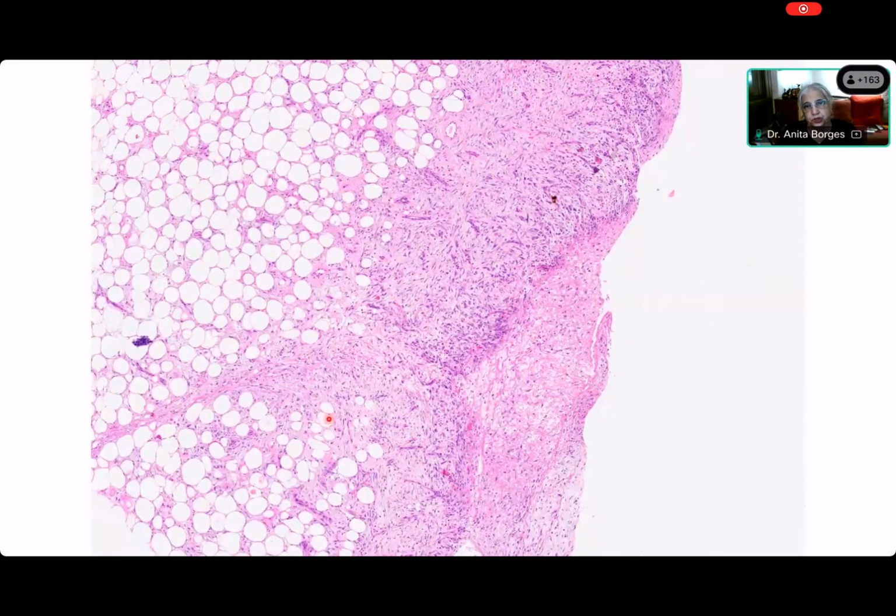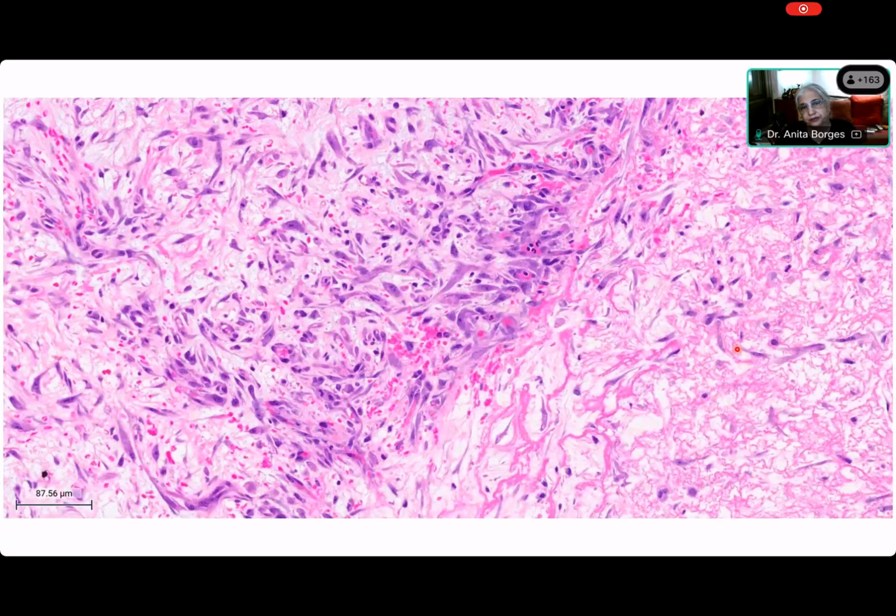It looks infiltrative into adipose tissue. And there seems to be an edge over here with something in it. Okay. What is that thing in it, Elsa? What is all this material? It's extracellular material. What is it? Fibrinous material. It is fibrinous material. Very good. So you have fibrinous material and it is bordered by this cellular tissue.